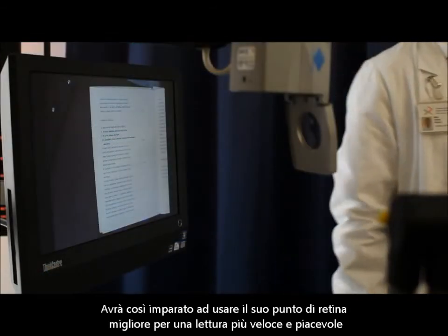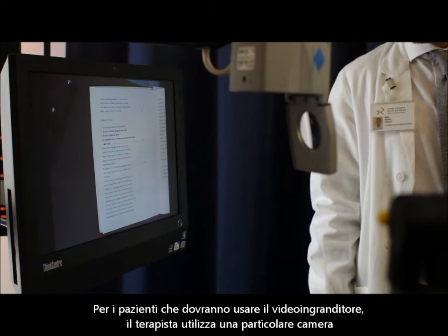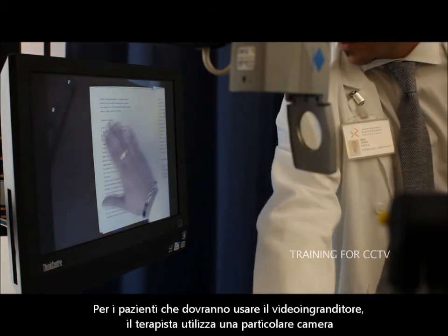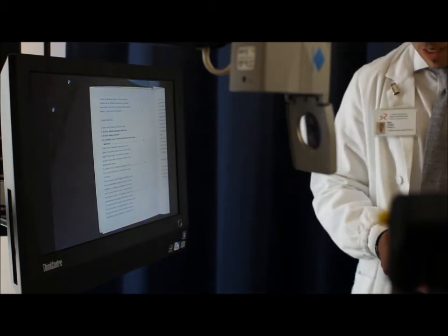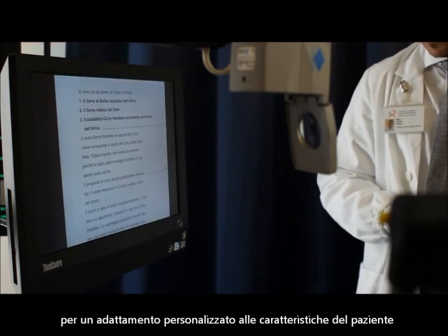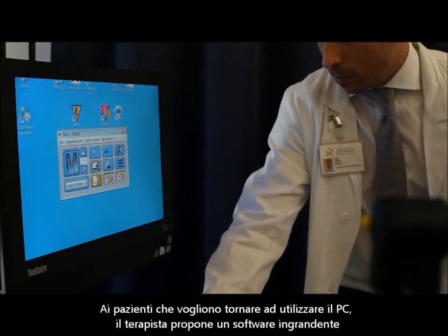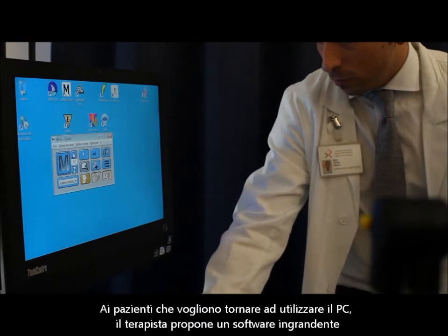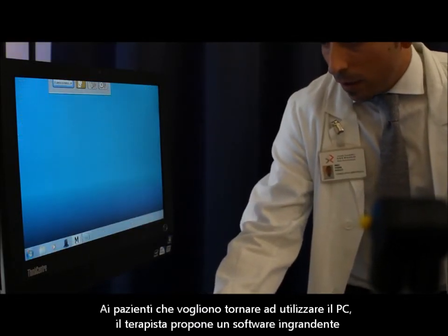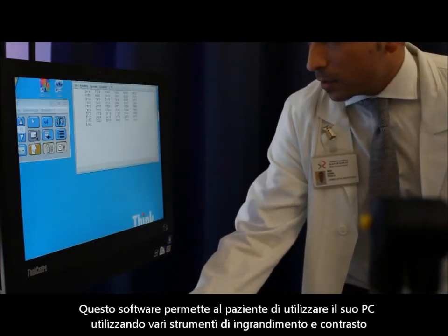For prolonged reading, it may be necessary to prescribe a video magnifier. In this case, we can activate a camera connected to the computer of the low vision workstation so that, without moving the patient, we can show him how this device functions, and we can then see how the patient responds to the solution and decide together if it is convenient to add a vocal synthesizer when navigating a text or the internet.